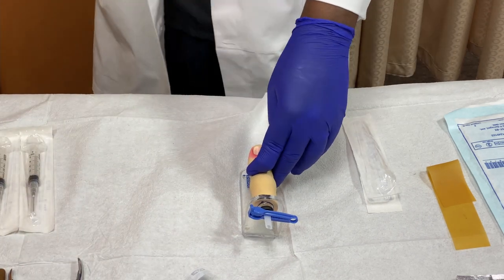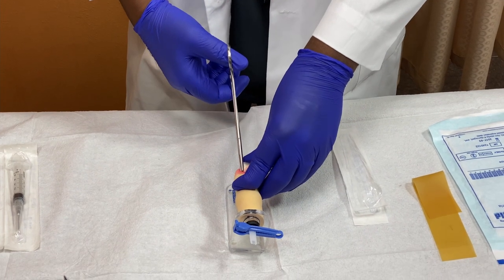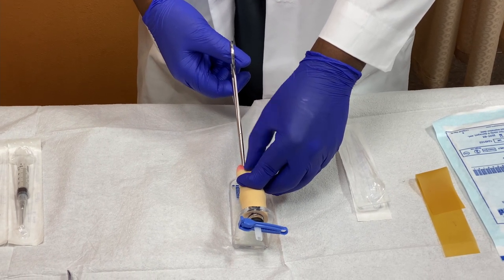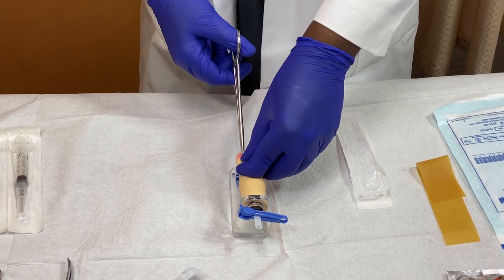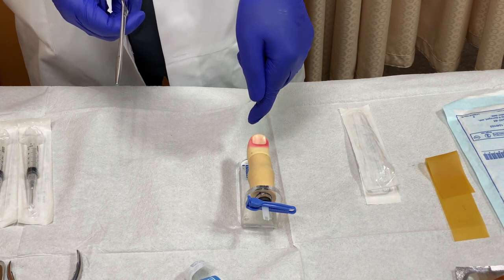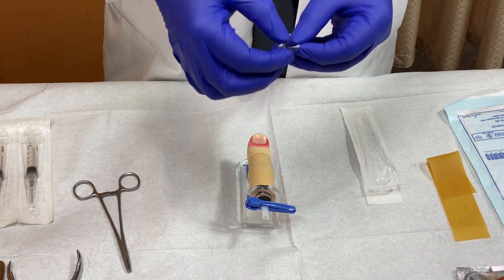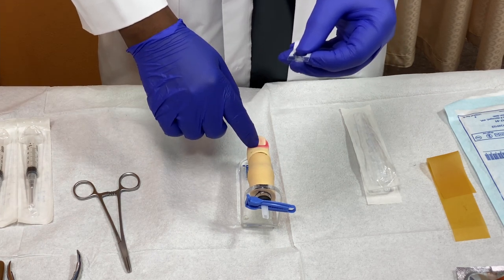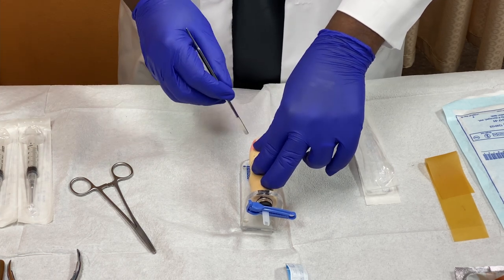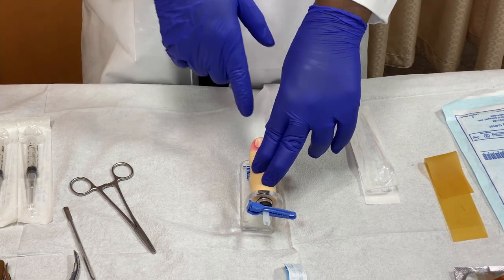After making the cut, take the hemostat and grasp as much of that lateral portion of the nail as you can — get as much into the jaw of the instrument as possible. Then twist away from the ingrown toenail portion and pull backwards. After you've done that, there should be a new sulcus where the nail used to be. Examine the nail to make sure no part remains in the proximal sulcus. If any part remains, go back in with the elevator and scissors to clean out that area — any remaining piece can cause inflammation, infection, and recurrence of the problem.